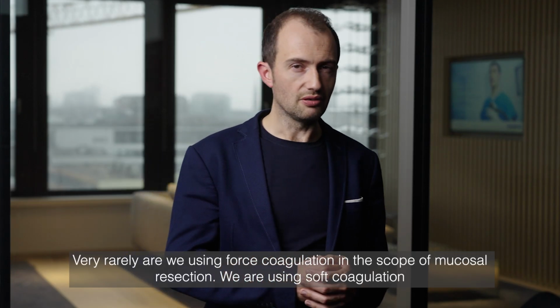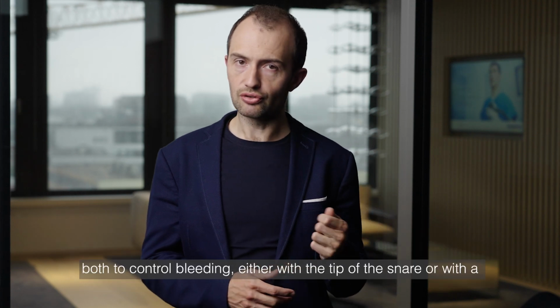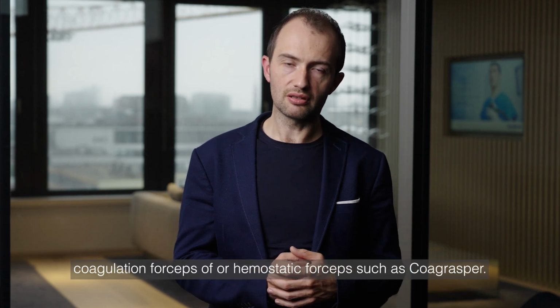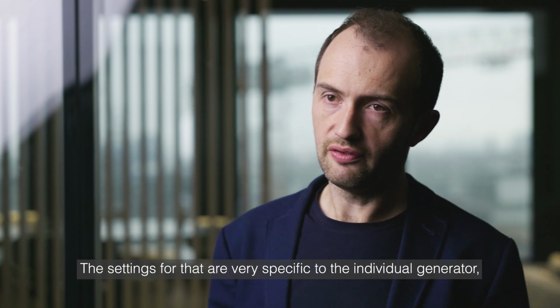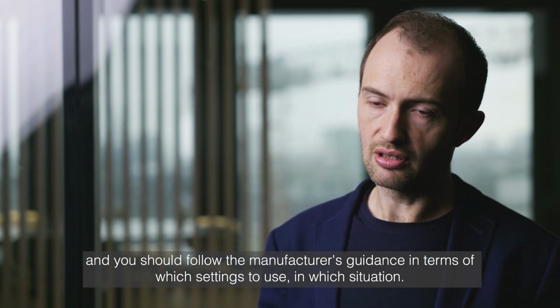Very rarely are we using forced coagulation in endoscopic mucosal resection. We are using soft coagulation, both to control bleeding, either with the tip of the snare or with a coagulation forceps, a hemostatic forceps, such as a coagrasper. The settings for that are very specific to the individual generator, and you should follow the manufacturer's guidance in terms of which settings to use in which situation.